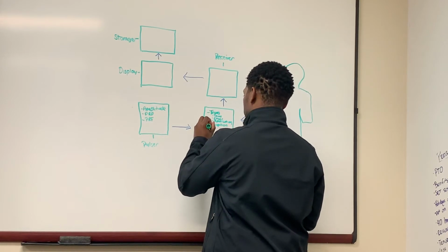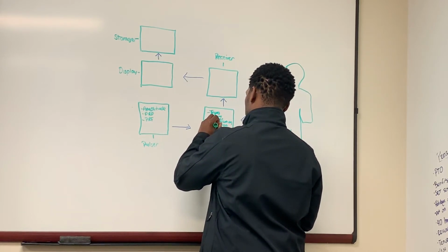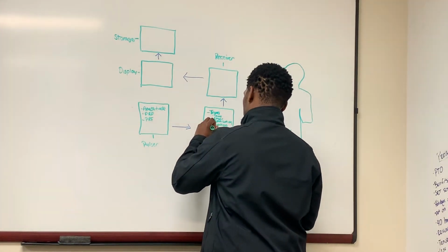And during reception: dynamic focusing and dynamic aperture.